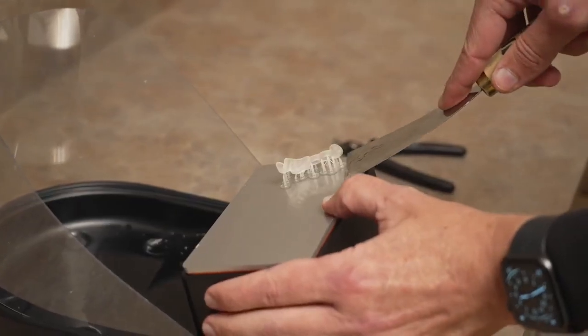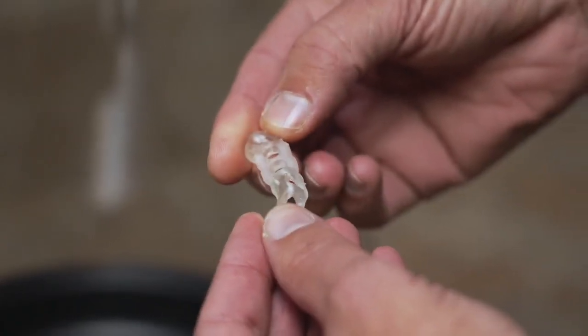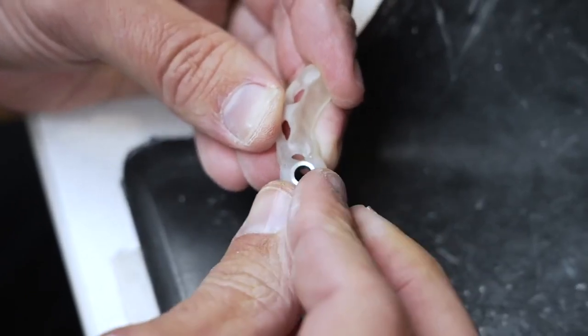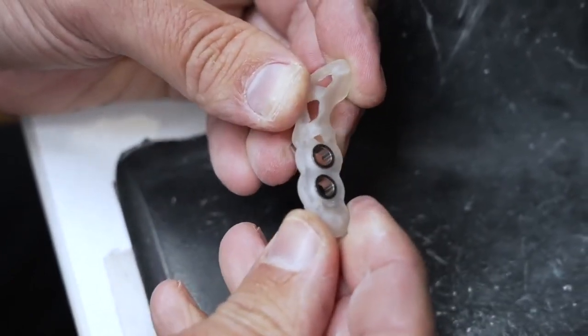She's going to go ahead and remove the surgical guide from the build plate. The next step is we're going to place the correct sleeve into the surgical guide. If you've ever 3D printed guides before, you'll remember that oftentimes these have to be forced into place. It's nice that the accuracy is high enough that everything slides in and it's a perfect fit every single time.